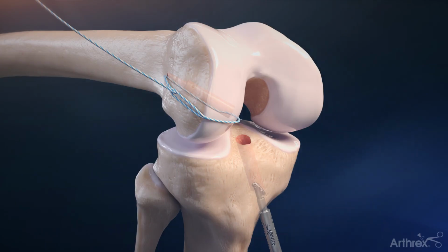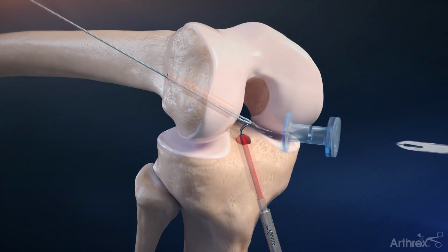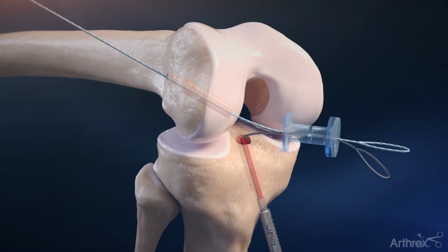Remove the FlipCutter III drill and pass a black and white fiber snare suture through the sleeve. Retrieve both the fiber snare sutures from the medial portal and remove the stepped drill sleeve.